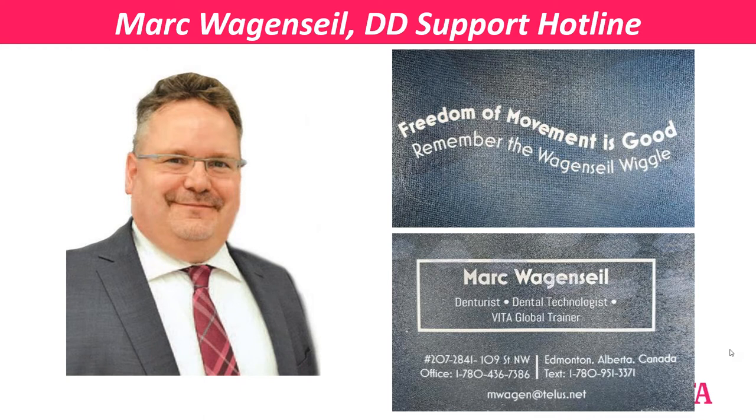All right. On the posterior, how do you determine the occlusal width of your posterior teeth? That's a good question. Again, VITA, their mold guides, they set the posterior in relation and golden proportion to the anterior. So they will give you the size match. Sometimes I don't follow that proportionate rule, even though I trust VITA that they golden proportioned it. I'm looking at the amount of space and the width of the ridge and the width of the space on each individual arch, and how much tooth size I need for that specific person.